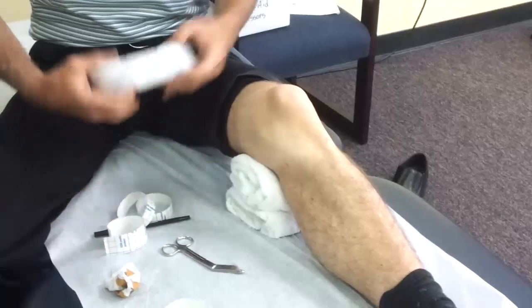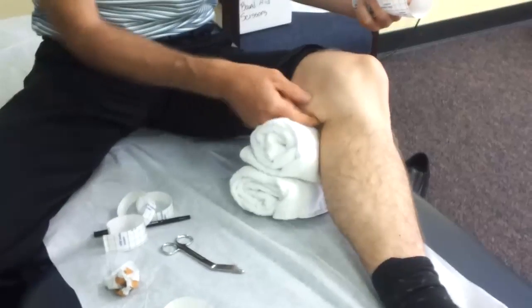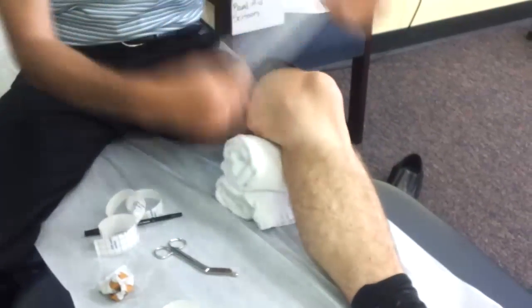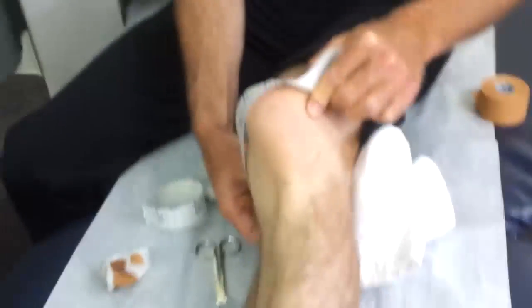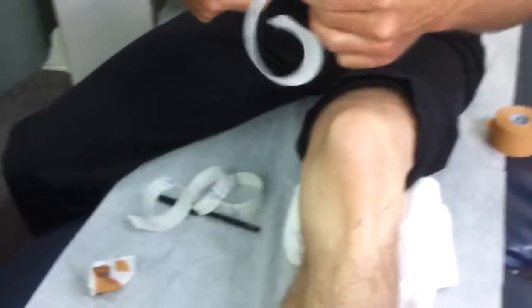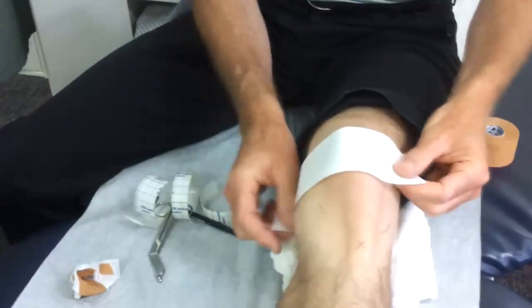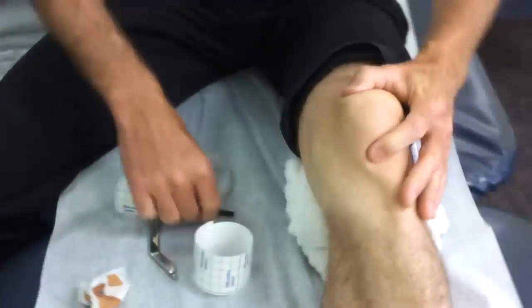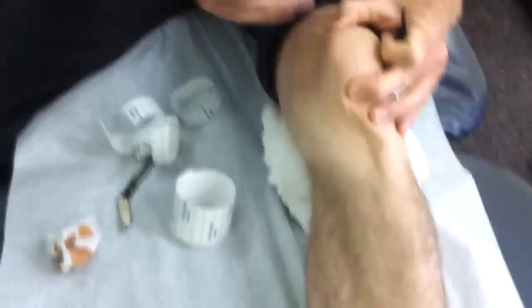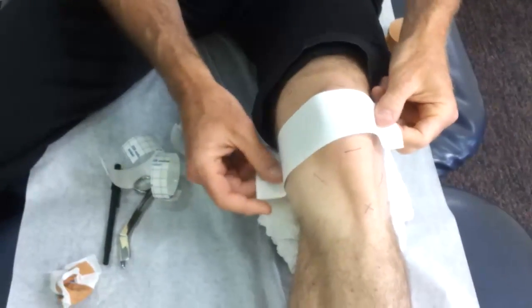We want to get a bit of tape and go around to basically the hamstring tendon — there. So we want to go from there and cover the kneecap, going about a centimeter beyond the edge of the kneecap. The trick — where most people get messed up — is putting the tape too high or too low. In the beginning, get a hold of that kneecap and draw lines on it, then place the tape so it goes in the middle of that.